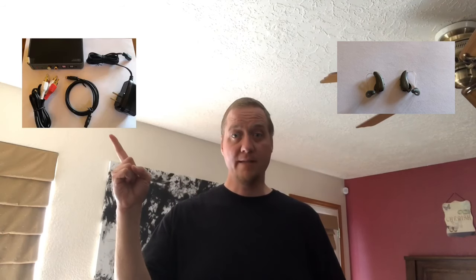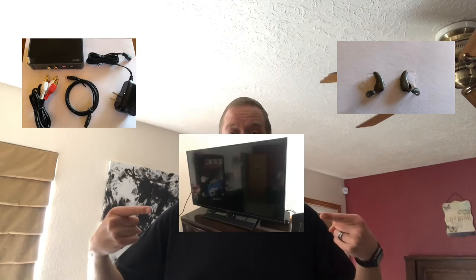First, you will need to make sure that you have everything you need. You'll need your hearing aids, the TV box, the supplies, and a television.